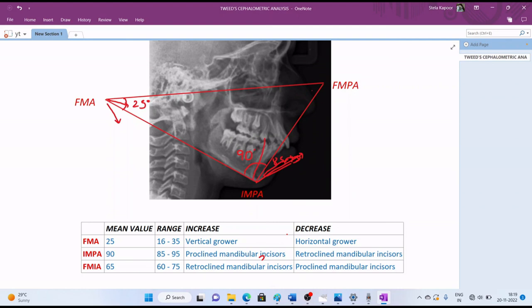Now for the FMIA angle, the mean value is 65 degrees with a range from 60 to 75, and it works opposite to that of IMPA. Increase in this value will indicate retroclined incisor, while a decrease will indicate more proclined ones. You can memorize this simple table for the values and implications, and that's all for Tweed's cephalometric analysis.